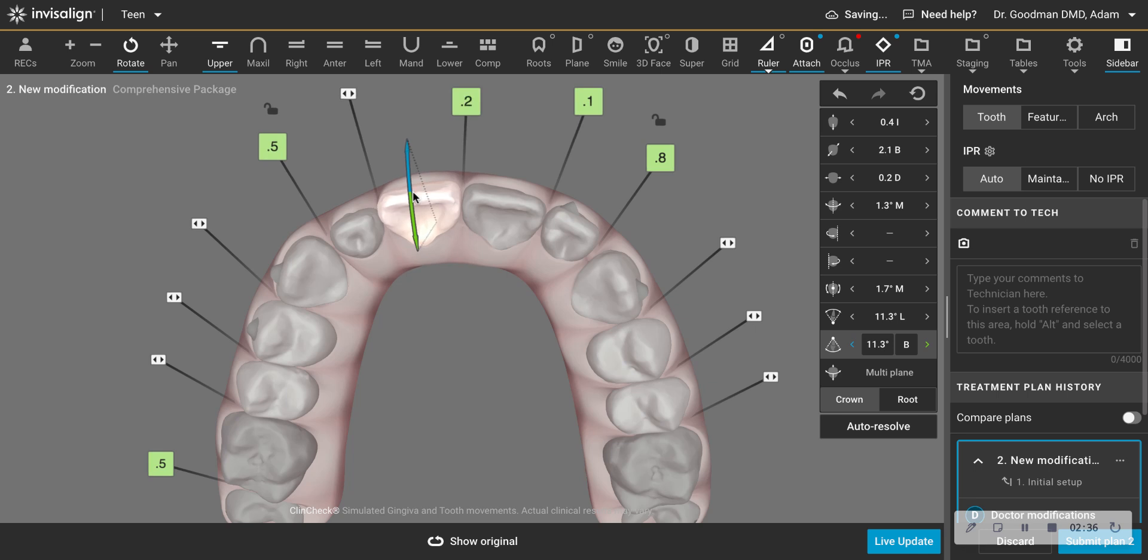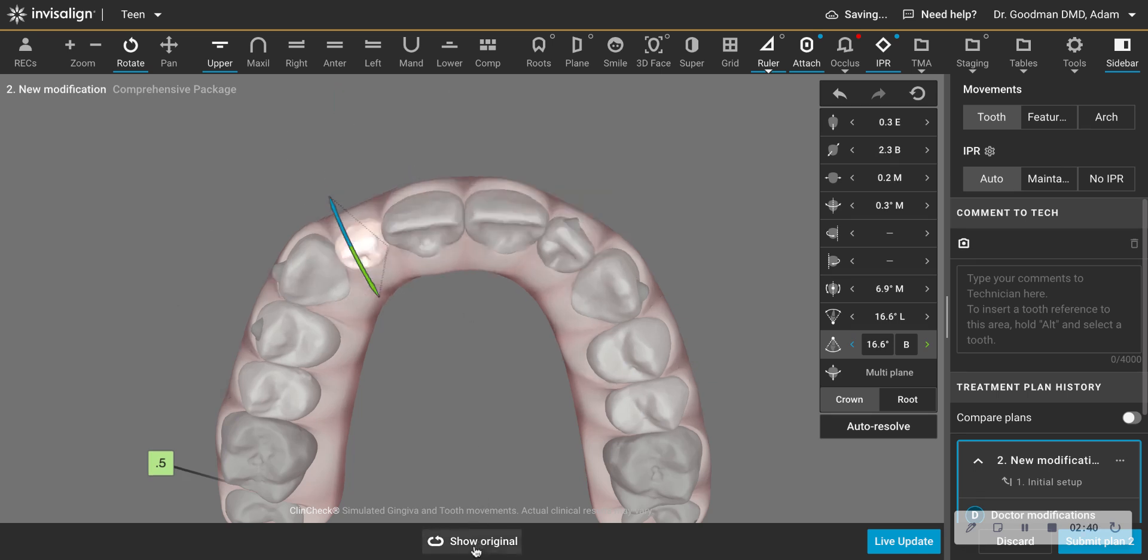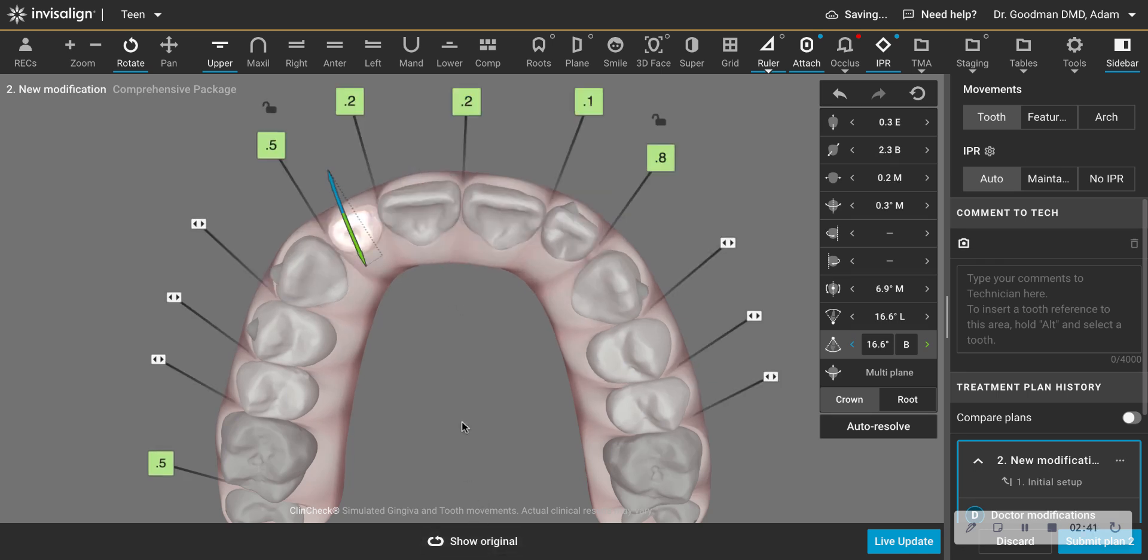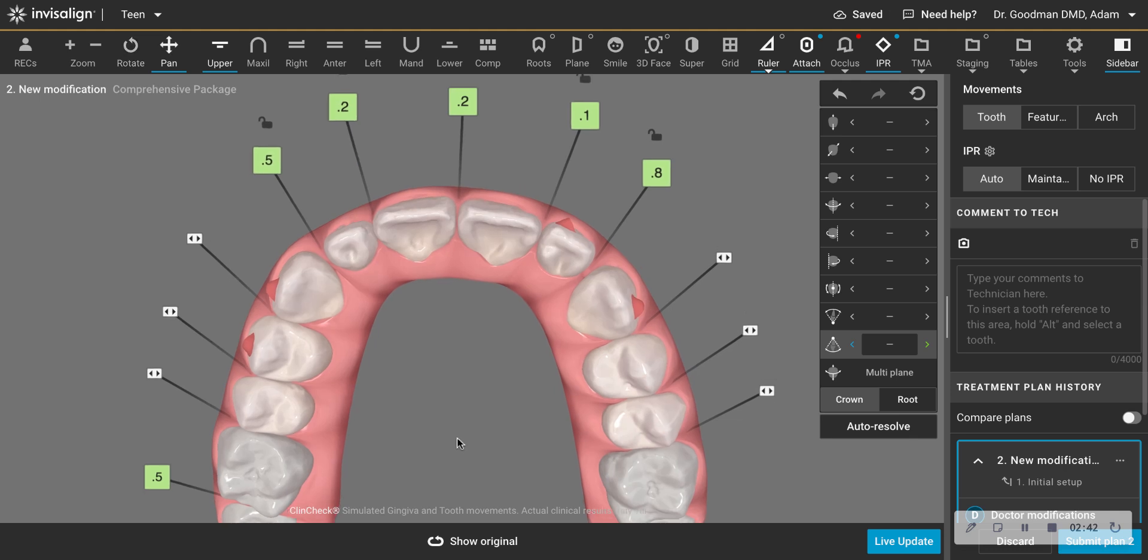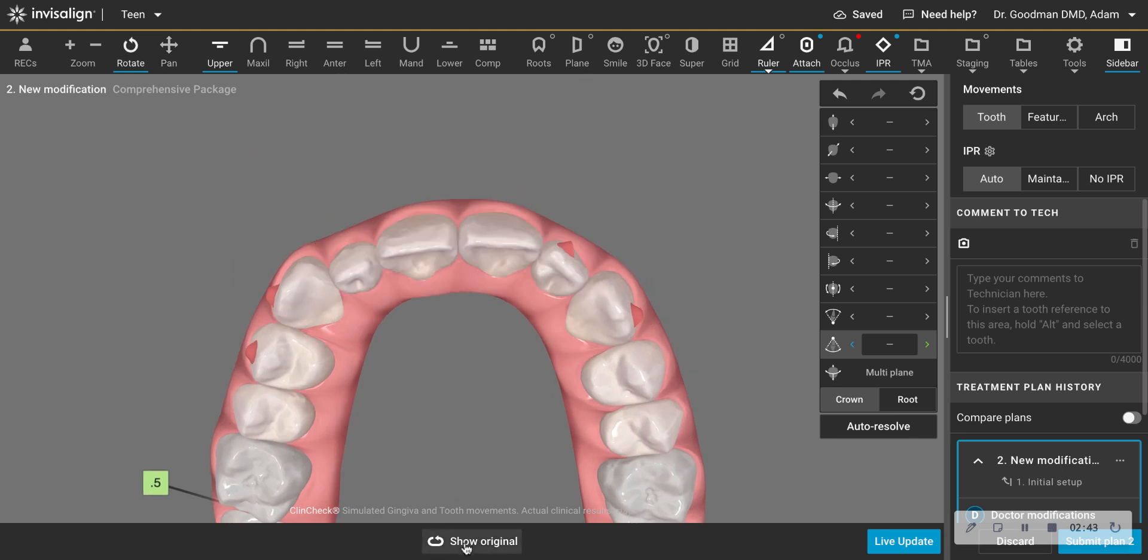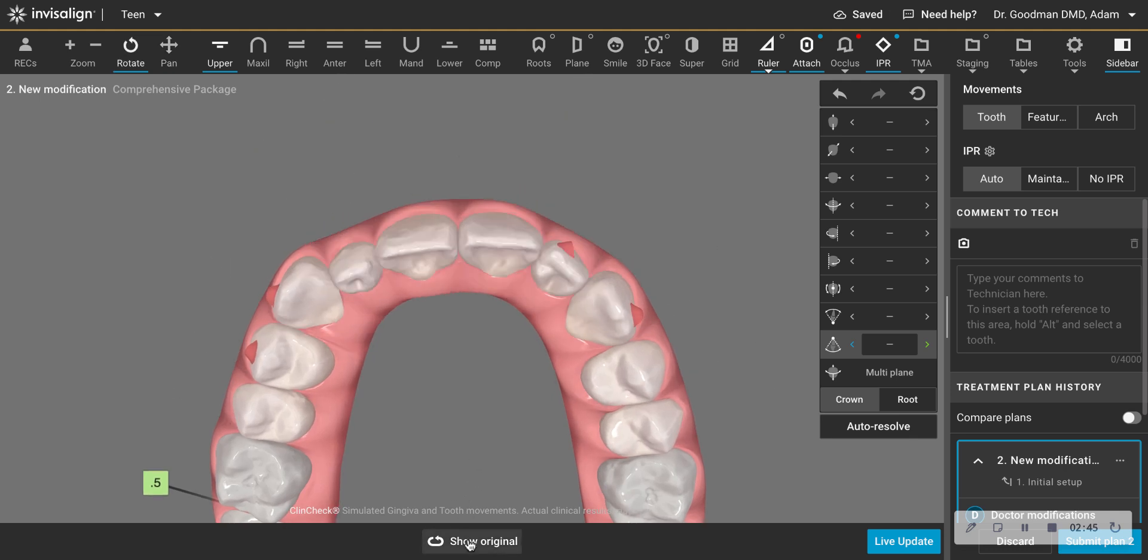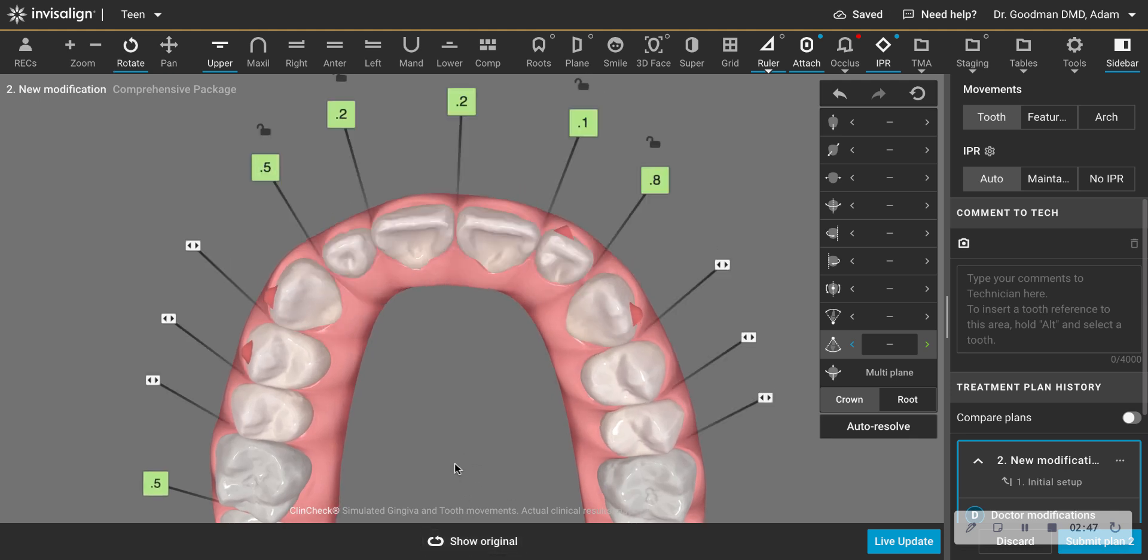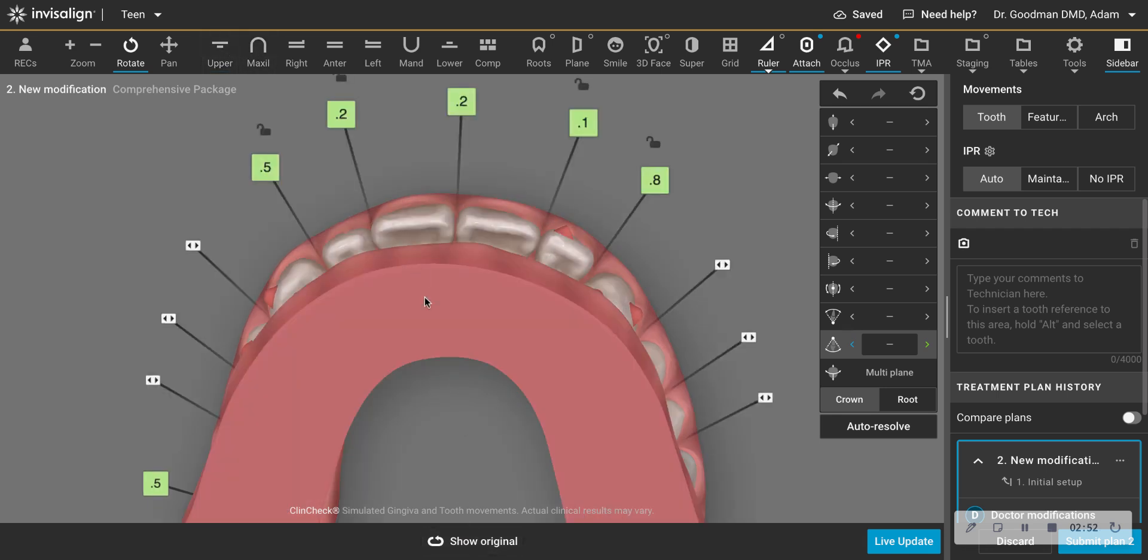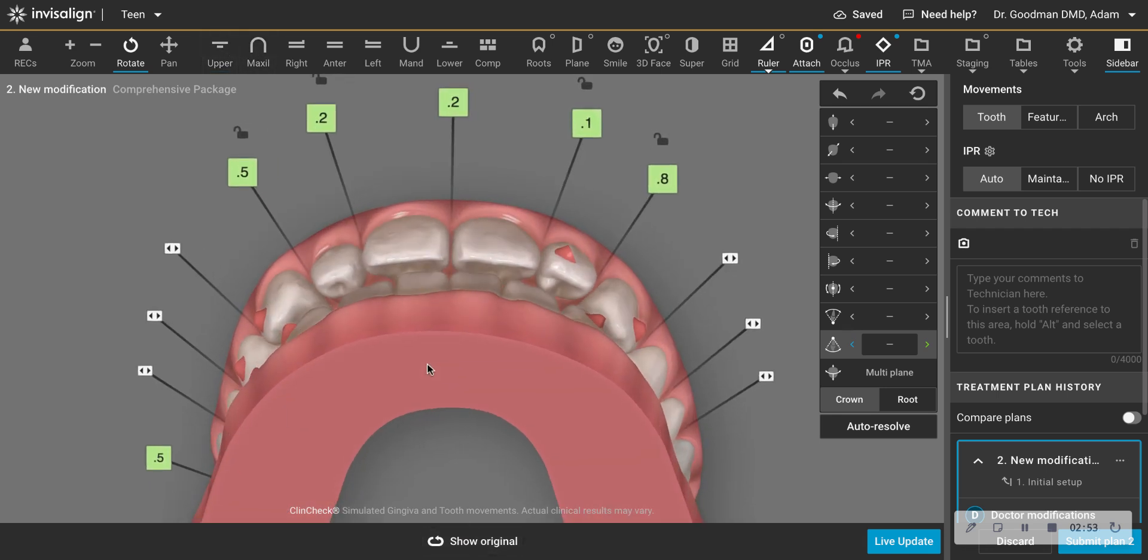So I've created more of a tipping movement. Okay, now if you look at the difference, an orthodontist will recognize that you can see a lot of the facial surface on the upper right one. And now you see less of it. You definitely see a tipping movement. And now I have a lot more overjet.